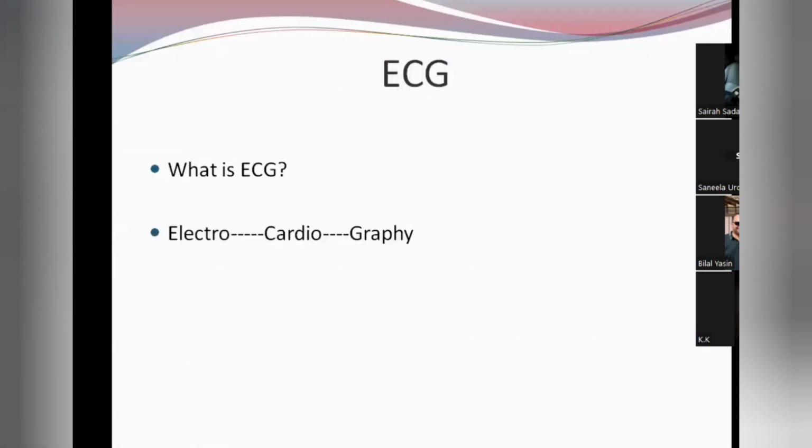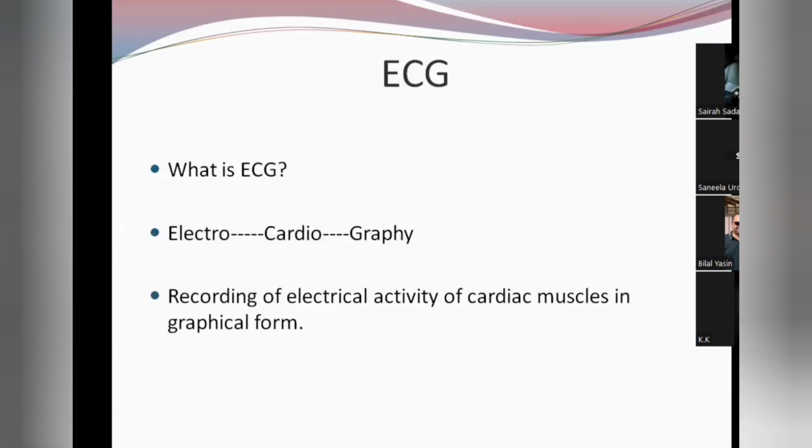Starting from the basics, what is ECG? ECG, as you know, is electrocardiography, the recording of the electrical activity of the cardiac muscles or the myocardium in graphical form. I will show you how the electrical activity of the myocardium can be recorded on a graph.